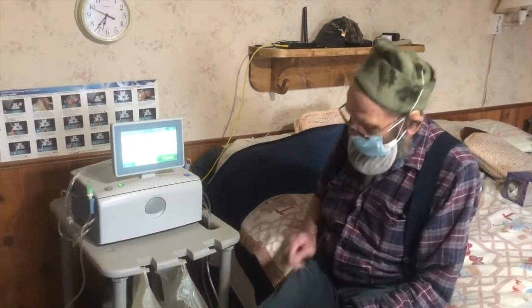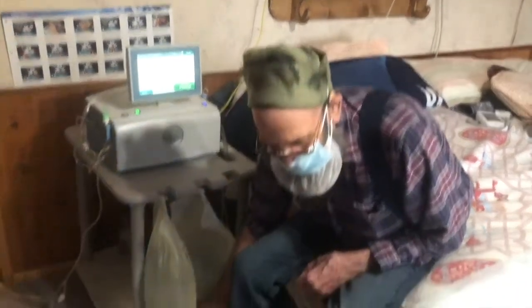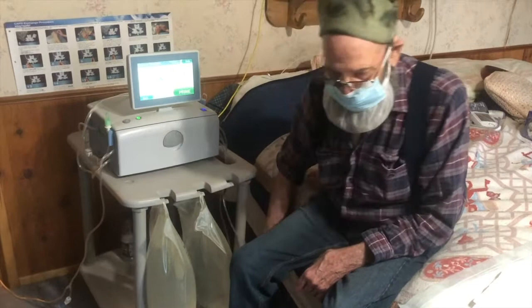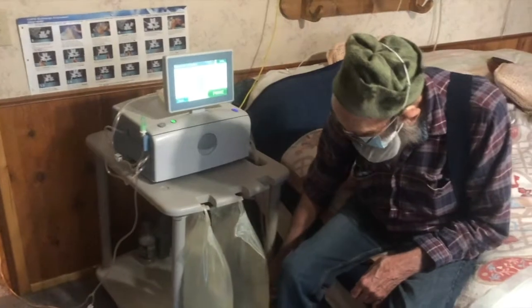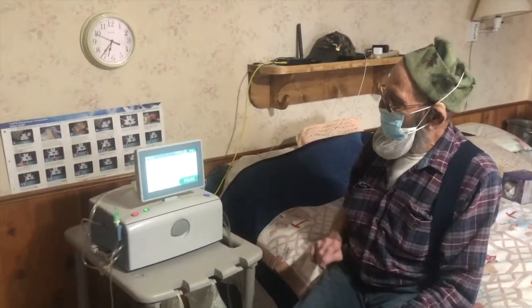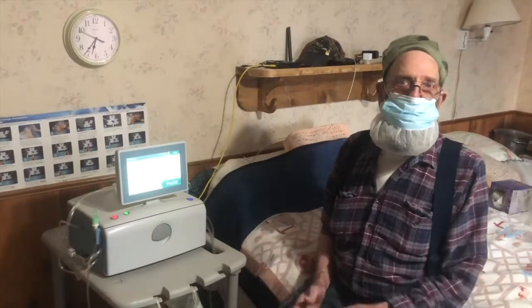So now, break the frangible seal on each connected solution bag line, then unclamp the solution lines. You break these little seals in here, you can hear it click, it's real distinct. You just break that seal, it's a little plastic seal, and it opens that bag up, and then you open your valves up on your bag so the fluid can get in and out. And now we're getting ready to prime. The system says priming, please wait. If anything is wrong, that thing will stop and you've got to figure out what's going on.